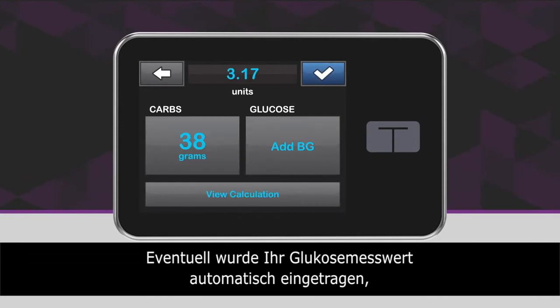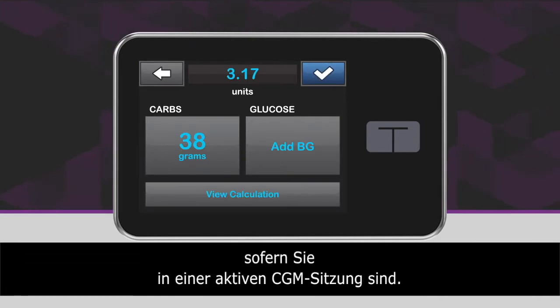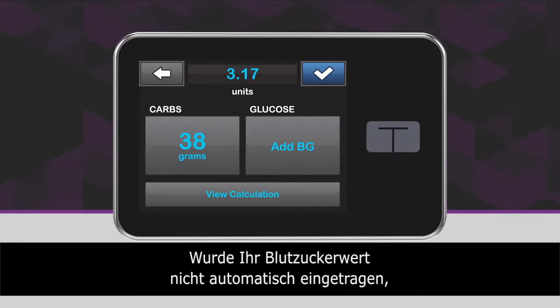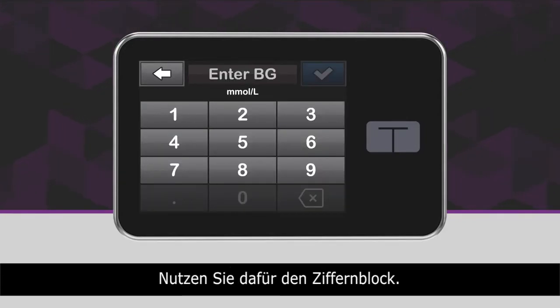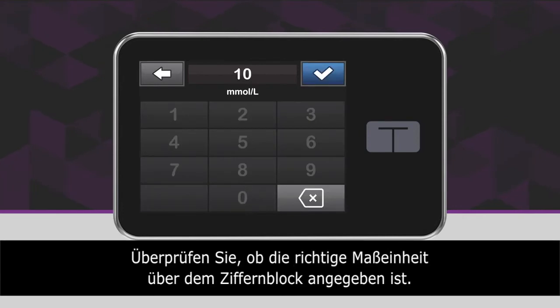Please note that if you have an active continuous glucose monitoring session, your glucose value might be auto-populated. However, if there is no auto-population of your glucose value, simply tap Add BG to enter your blood glucose. Use the keypad to enter your glucose value. Be sure millimoles per liter is displayed above the keypad when entering BG values.